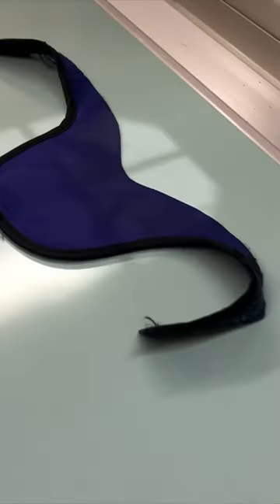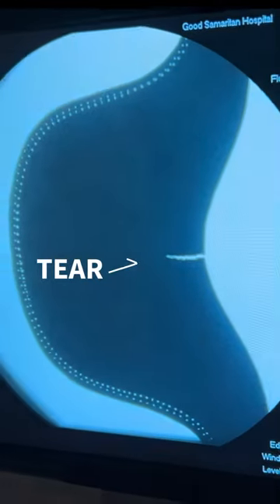This thyroid shield looks intact, but when you put it under the x-ray, there's a big old tear. Sometimes the lead feels intact, but when you put it under the x-ray, there's little holes, and that will let radiation into your body.